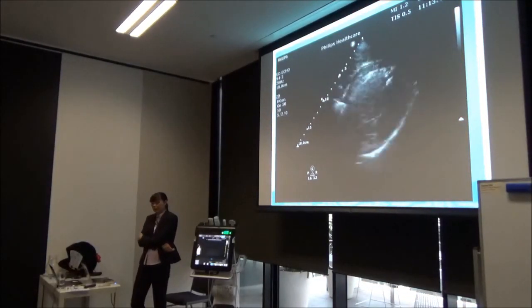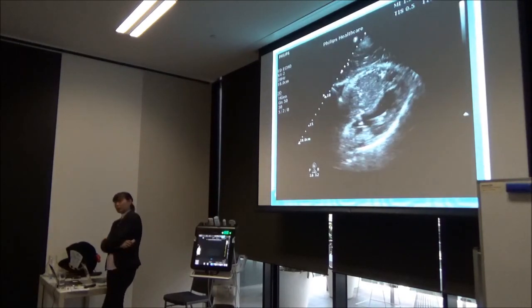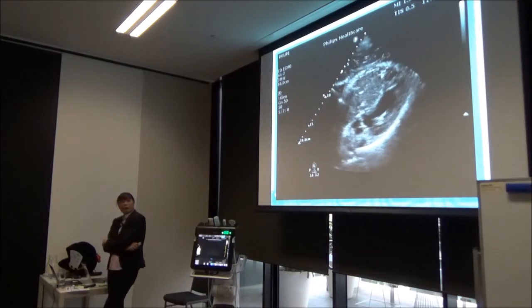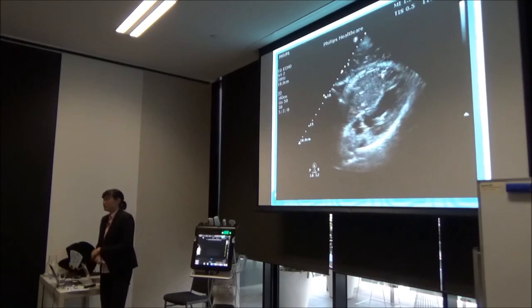A subcostal view again. What's going on? CPR, okay. First pulse check. Do we have an effusion? No? Okay. We know ejection sucks. Equality.